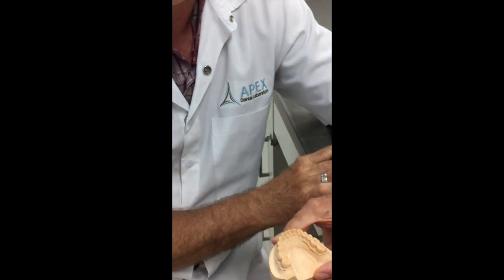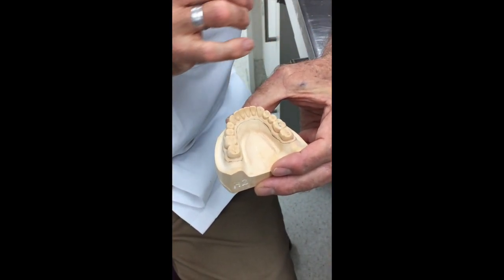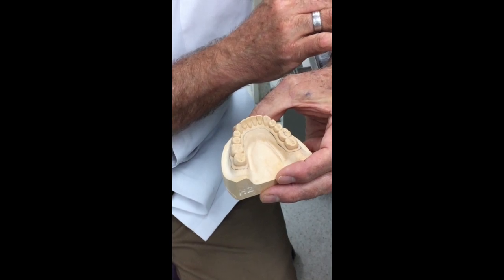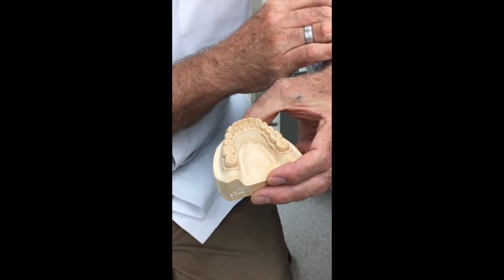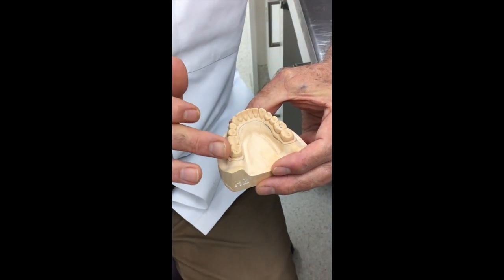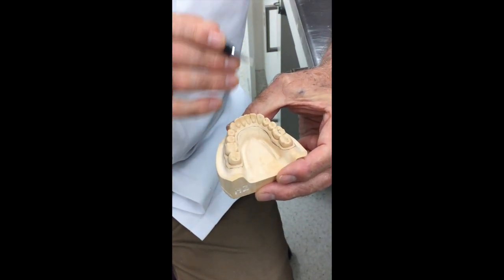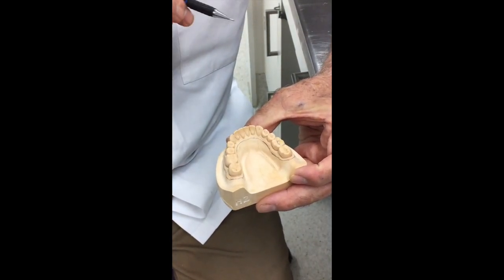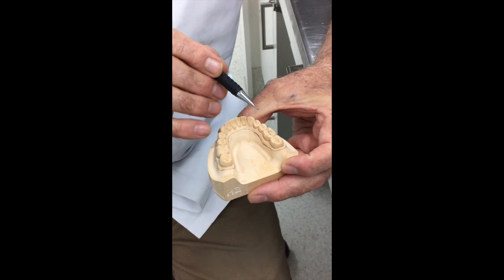If you can picture, if we just have the quadrant, this rotation can be anywhere, and we don't know if there's canine guidance on either side. So if we want to maximize the consistent result, we would try to get all of the arch into every impression, and that's why we're limiting the size of the tray, so it's easy for us to do that.